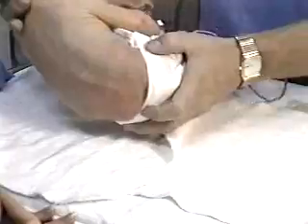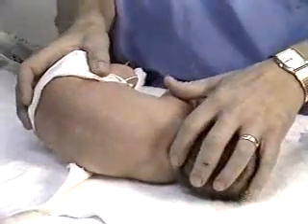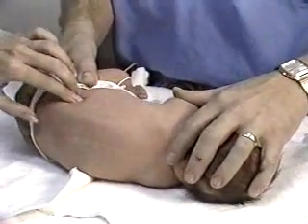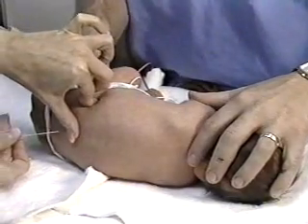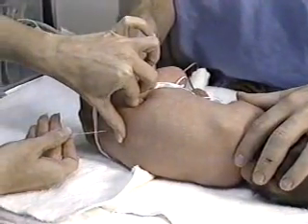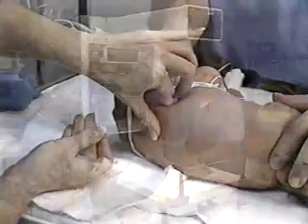The baby is now turned with his head to the right side to demonstrate the difficulty of performing the procedure for this right-handed practitioner. This position requires that the practitioner hyperextend her wrist to correctly insert the needle. The angle of this position is hard to control and difficult to maintain.